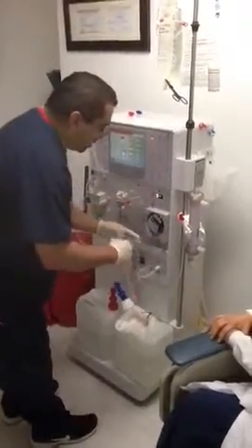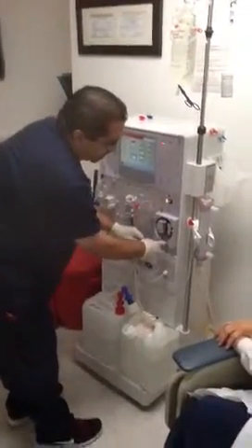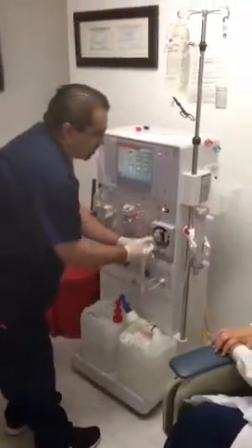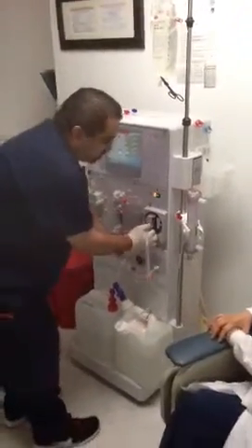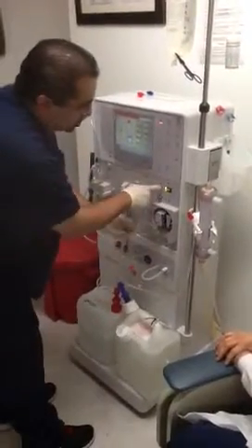Put it next to the dialyser holder. Open your blood pump door. You can turn this so the rollers are out of the way. Remember this goes in and out here. This little crown here has to be about a quarter inch below — just hook it in right there, get it in the little groove where it holds it in. Once that's in, push start.